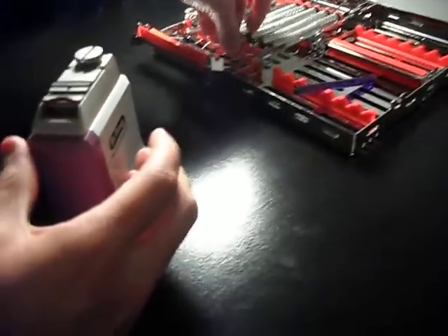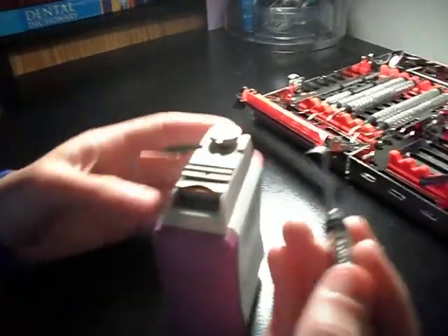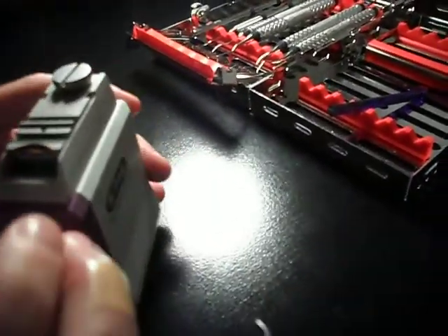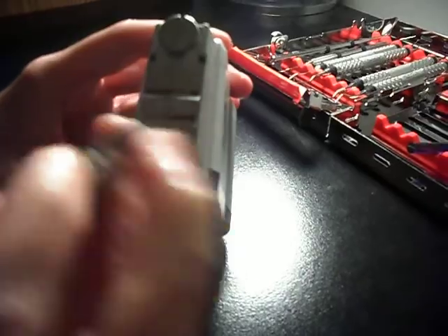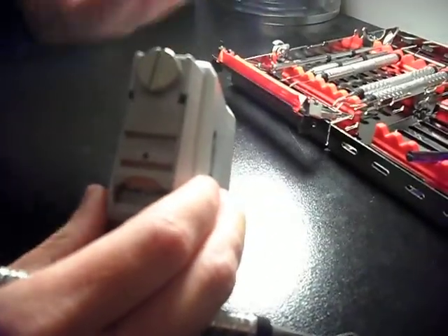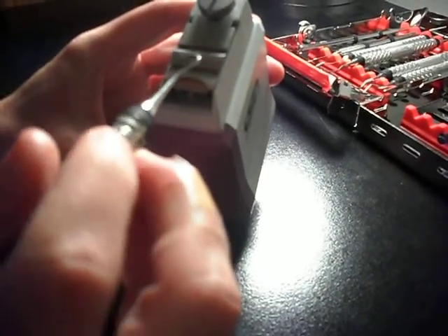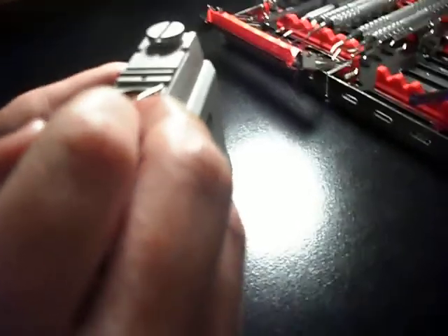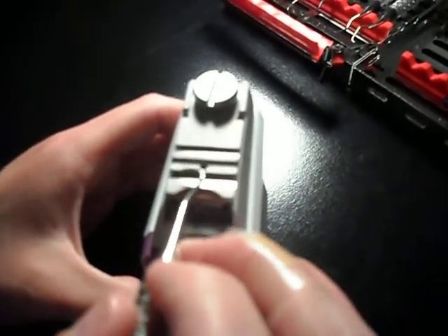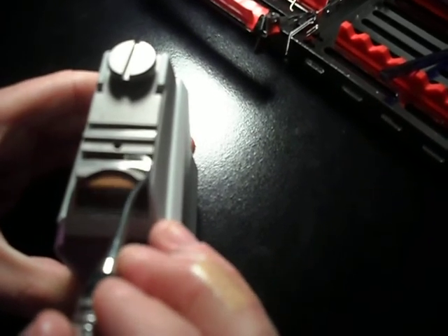Okay. Scalers are pointed pretty much all the way around. So, this G stands for Gracie, which is what the curettes are. Those go below the gum line. And then the S and U stand for scaler and universal curette, but we're not going to worry about the universal curette, just the scaler. So we're going to put the back of this scaler against the plate that says scaler, and we're going to turn on the sidekick.